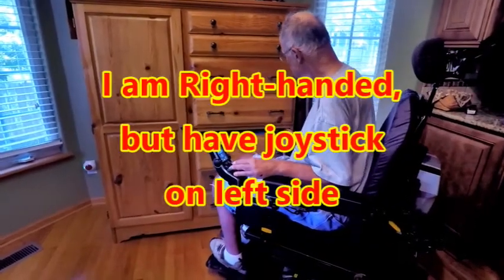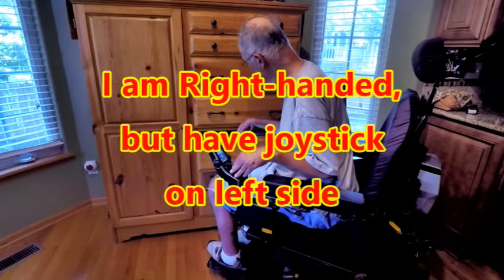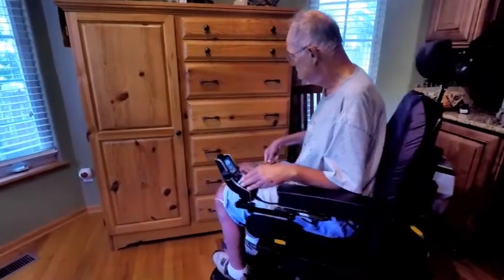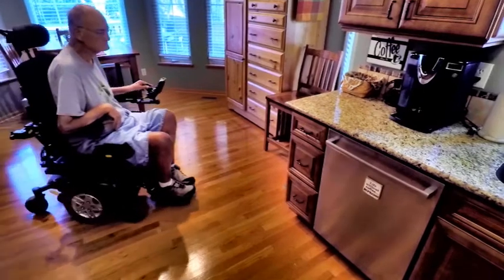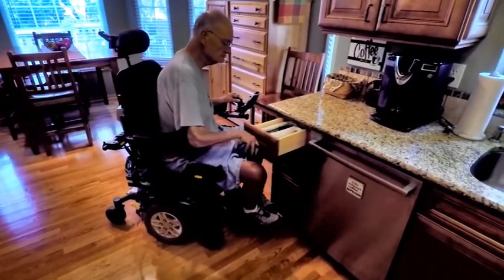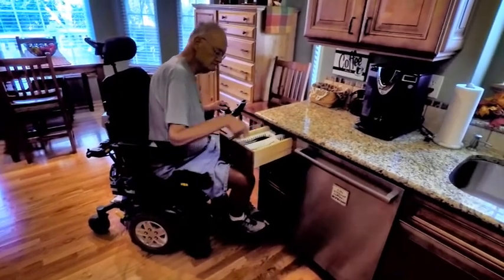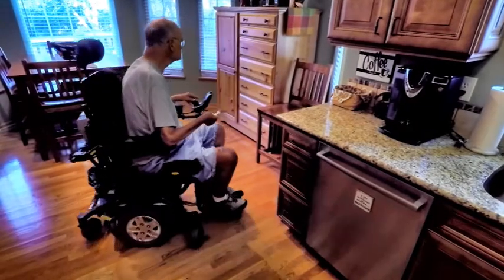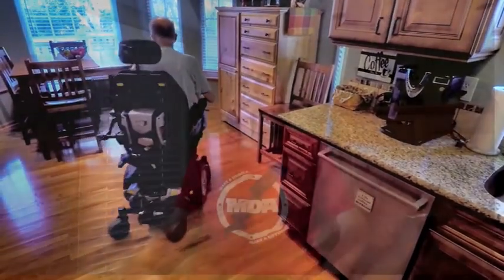Operating a joystick does not need a lot of hand dominance, so why not learn to drive your power chair with your non-dominant hand and allow your dominant hand to do more important things like using your stronger hand to open a door, open a drawer, carry a dish, lift a small object, or grab something off the store shelf, etc. If you are right-handed and your joystick is mounted on the right side, will a joystick control be in your way while sitting at your desk using your computer mouse?